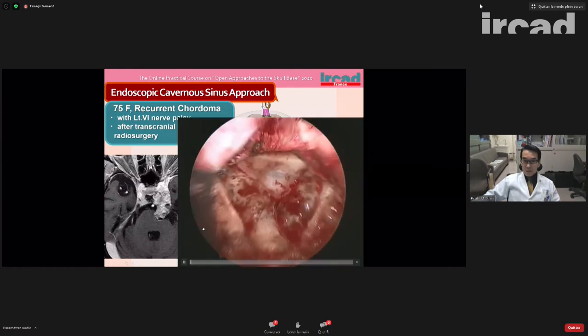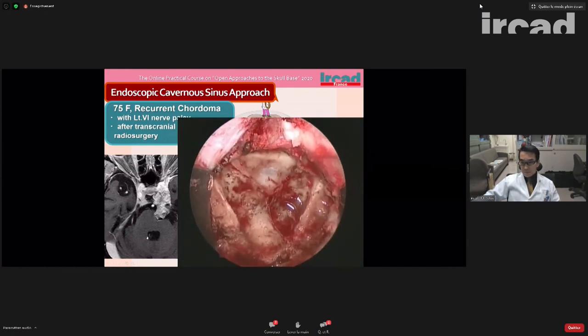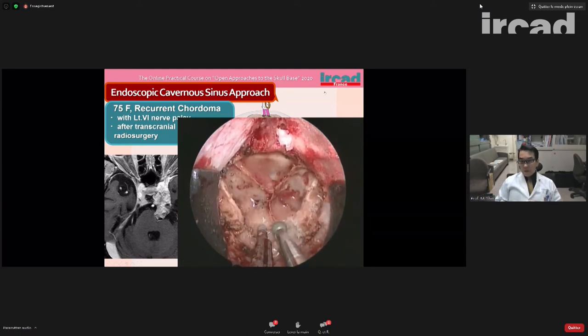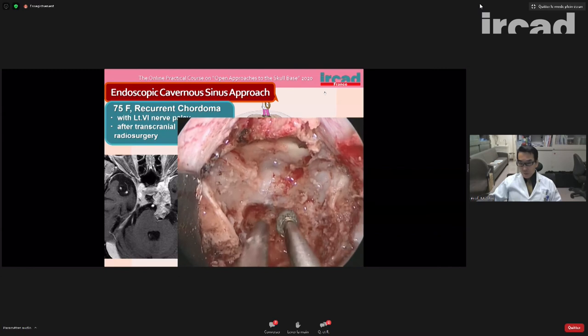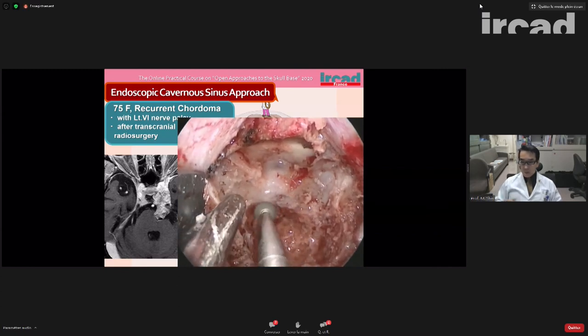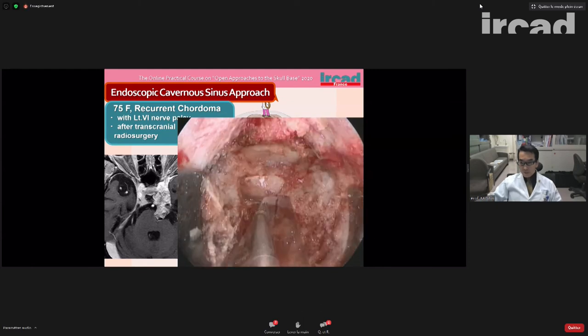I will show you a case. This is a recurrent chordoma case. So I'm drilling off the sphenoid floor and also the sella floor, and the bone removal was extended to the lateral.